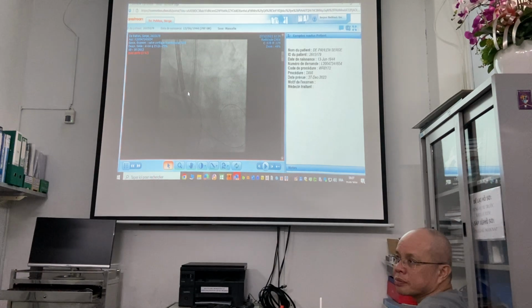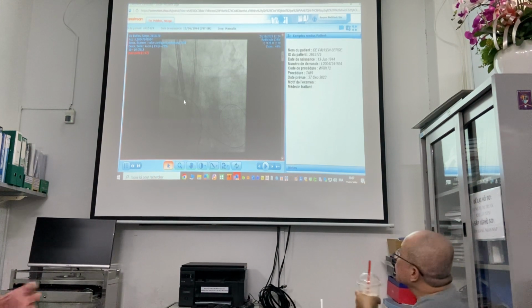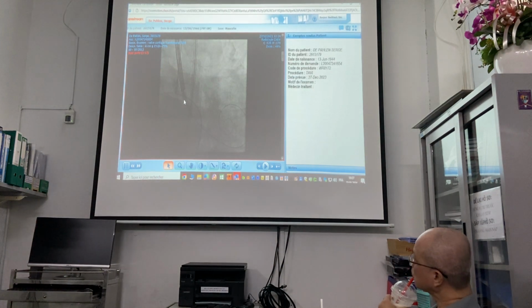Your company has the Allegra valve, which is a little bit the same style. It's also a valve where you gently deploy the valve. You have the balloon-expandable or the self-expanding valve. This is a self-expanding valve. The problem is that the image quality is not very good.